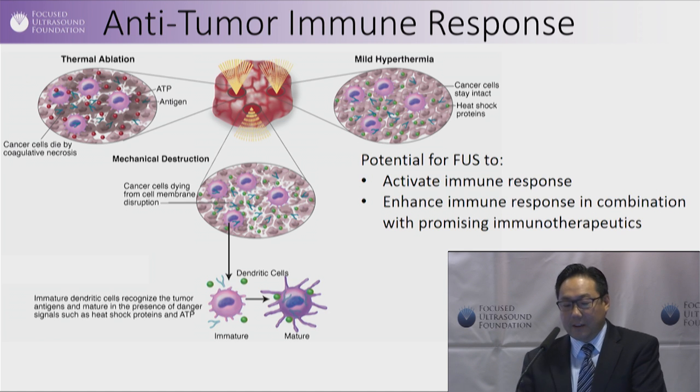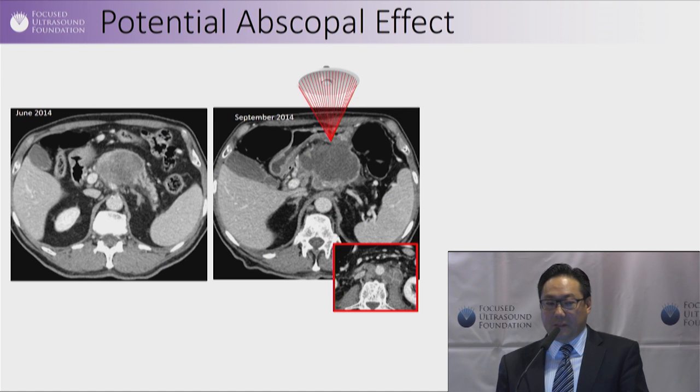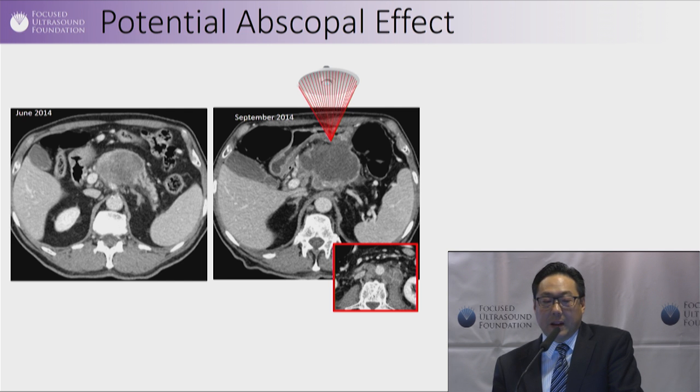What's exciting is that there are clinical examples of this that are driving this. This is a slide from Dr. Orsi from Italy, and on the left-hand side you see a CT scan, and in the middle of that scan is a tumor. It's a pancreatic cancer. And in the second slide to the right of that, where the HIFU cartoon points to, that is following ablation, and what you see is a darker area because contrast has been administered and there's no contrast penetrating that, demonstrating that this particular tumor has been ablated.